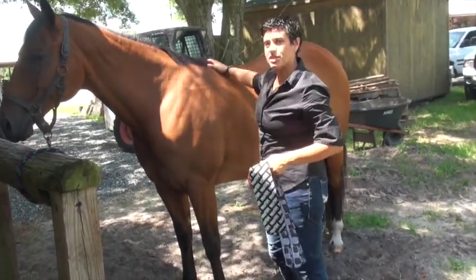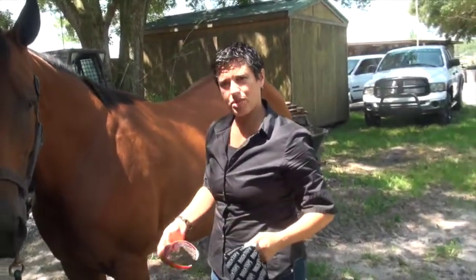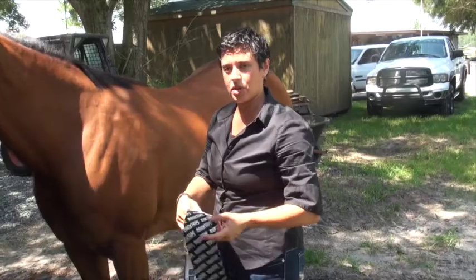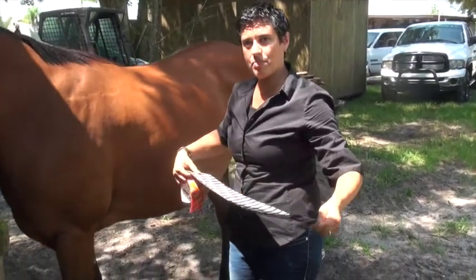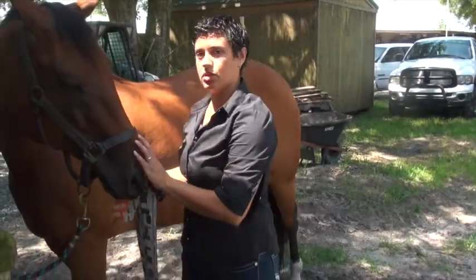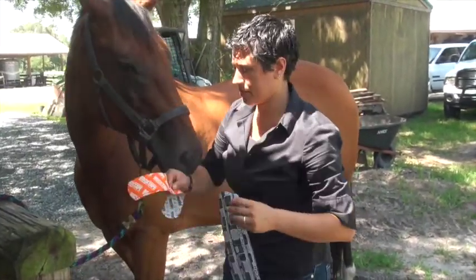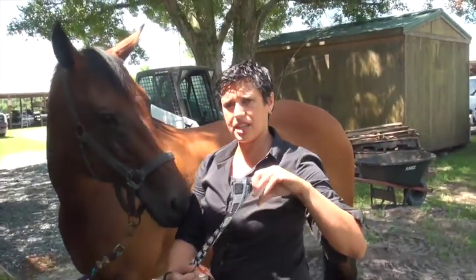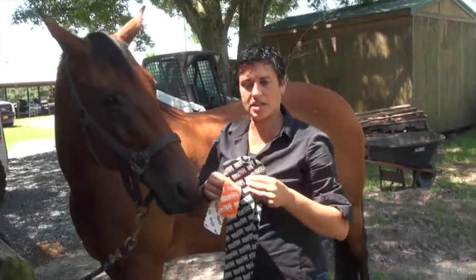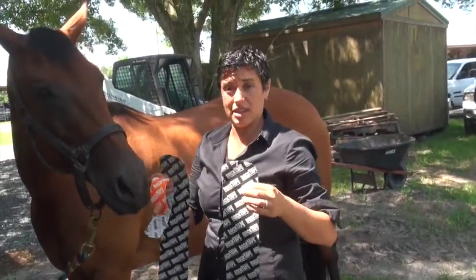So what I want to show you today is just a common taping, one that I do pretty often on a lot of horses that I come across, which would be the back pain reduction taping, also known as the longissimus dorsi support taping. So what we're going to do for that is we're actually going to use the Big Daddy tape. Now I use rock tape because it comes in some really great sizes, and it's also stickier than other tapes that I've found.